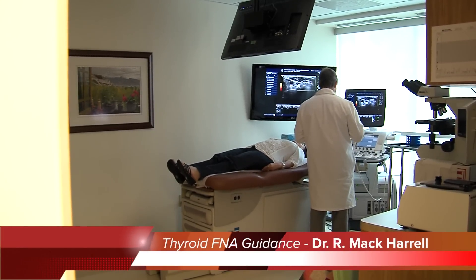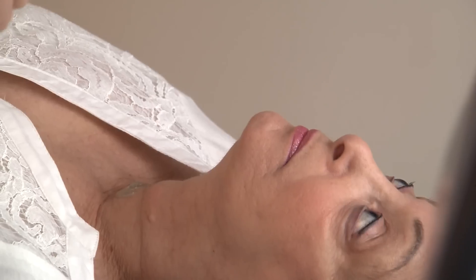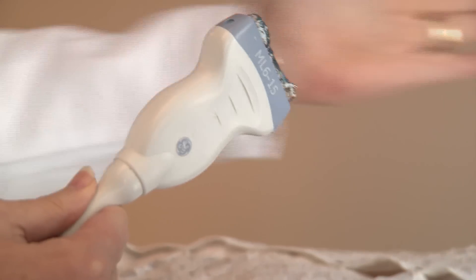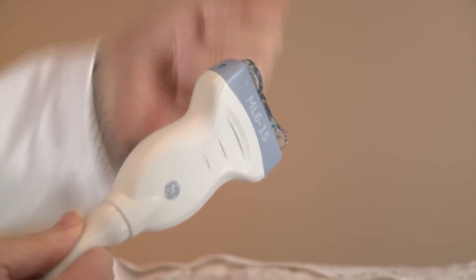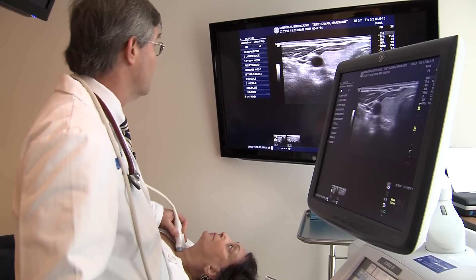This is a very sophisticated probe that shoots sound into your neck. The sound bounces back to the probe and gets turned into an image on our flat panel screens and on this screen that you can see. It actually resembles the way your neck looks inside — it's like we made an incision and looked inside, so we get to see everything. I want you to raise your chin nice and high.